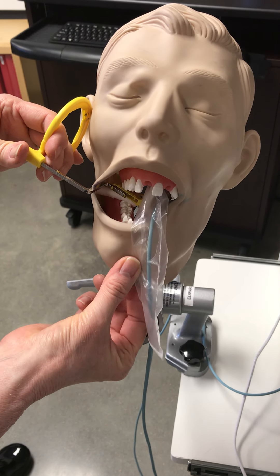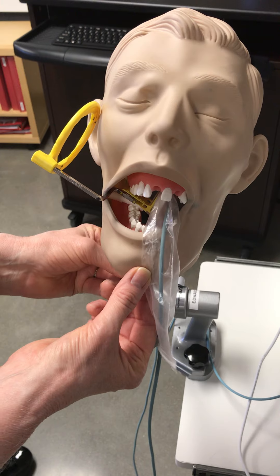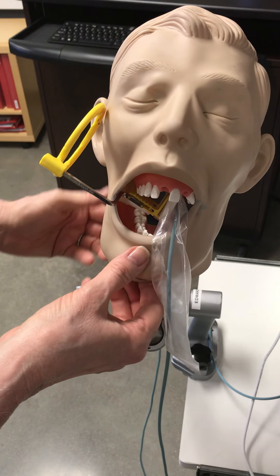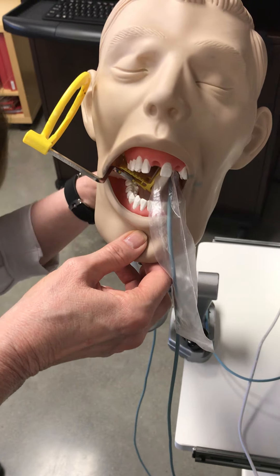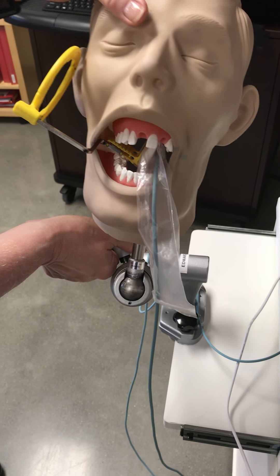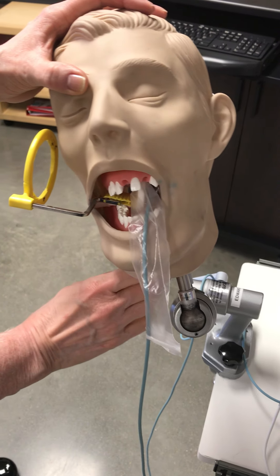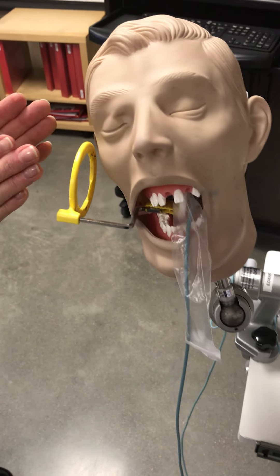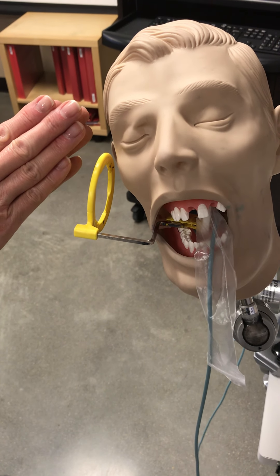Place it under — see, I never really touched that, I'm only touching this. Turn this, lock it down — see, it opened. Yeah, that's what I need to know. Now it's tight. Okay, then you loosen perpendicular. Now what you also have to know is the teeth, because of the rotation — his teeth may not grow this way, they're slanting in there.